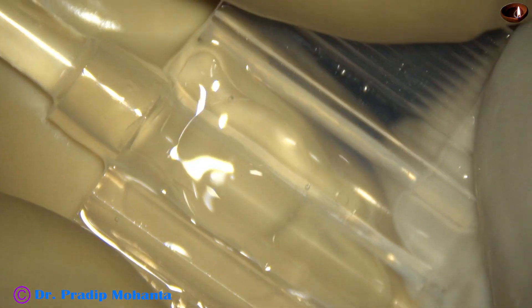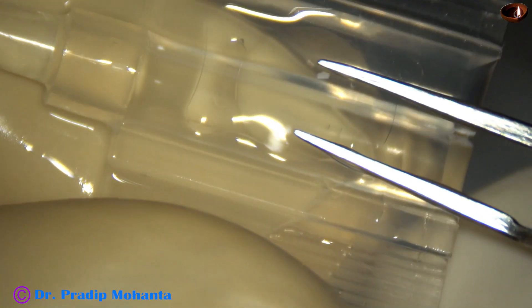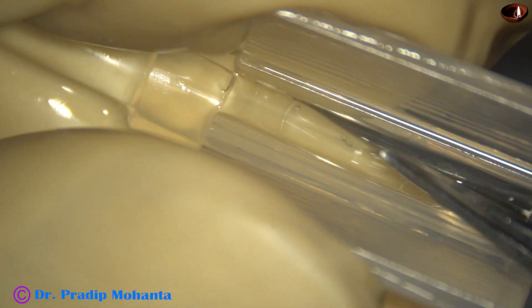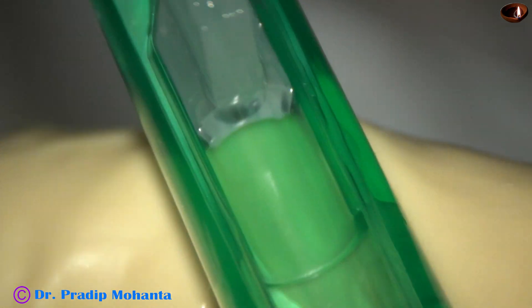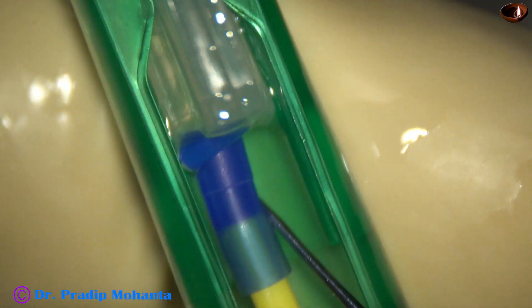The main wound has been enlarged a bit. This is the intraocular lens and this is the cartridge — you can call it a butterfly cartridge — that we are going to use. As I place it on the injector, the plunger doesn't go in the right path, so we lift the silicone plunger a bit and it goes into the passage correctly.